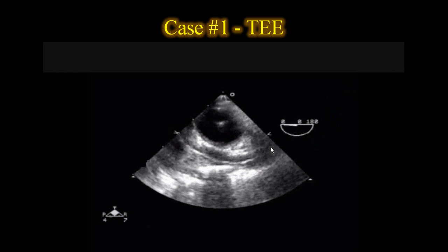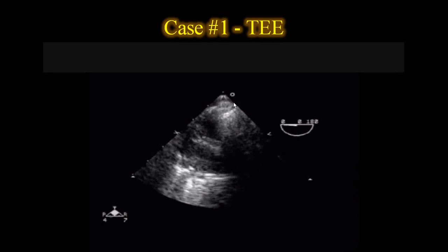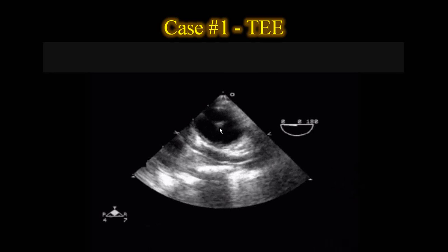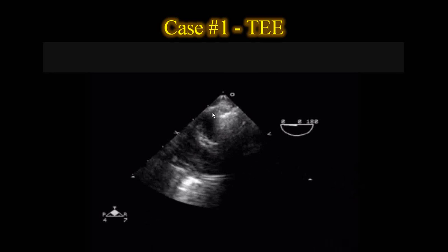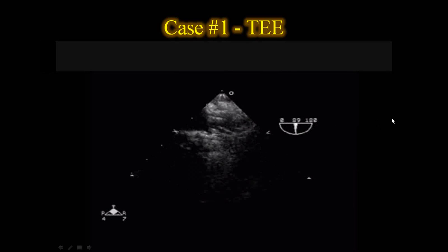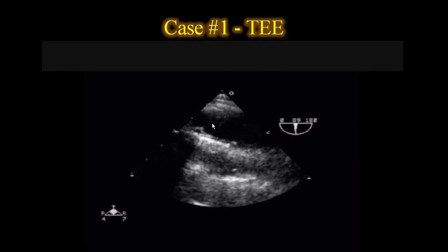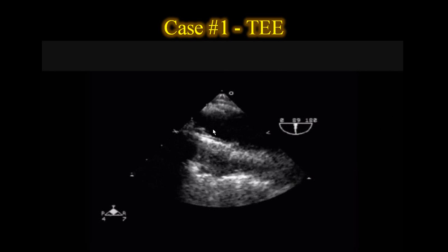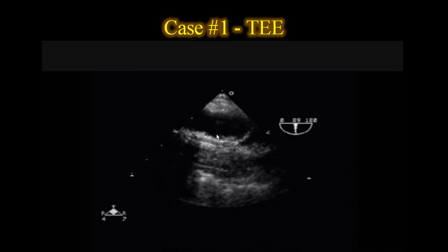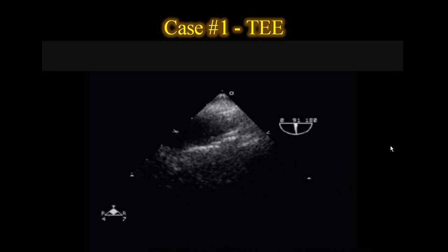So this is exactly where the surgeon wants to put his percutaneous stent, and you can see him getting ready. His catheter is ready to go, and the balloon is starting to inflate. And this is actually hard to appreciate with echo, but in the long axis, I think you can see right here that the stent was just deployed. They're not extremely echogenic or easy to see, and that took care of the problem.